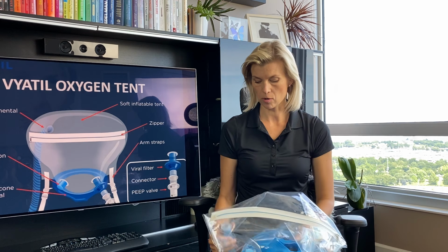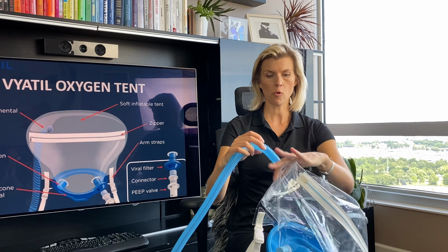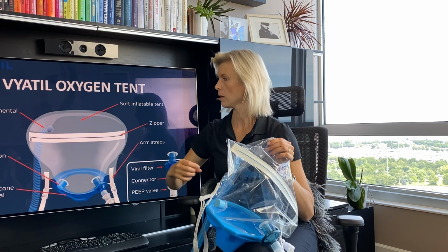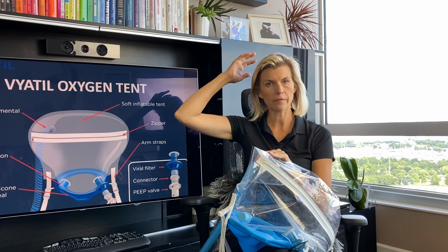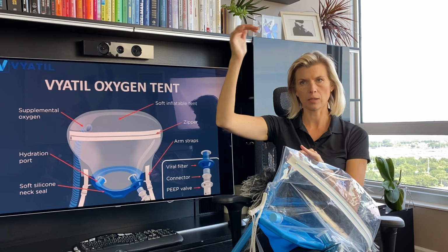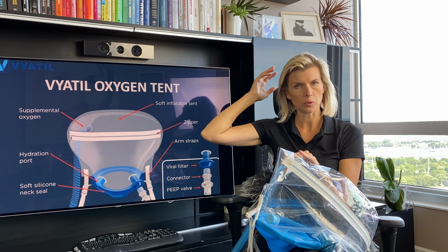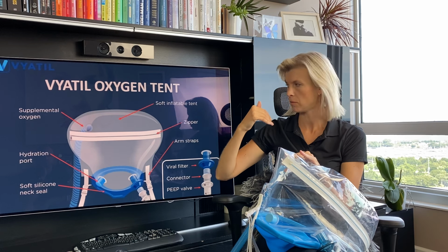And here is our input port for the air, and it's in the back of the tent. The reason for that is that it's more comfortable, it doesn't get in the way when the patient is moving, and also it is less noisy for the patient. It's not going straight into your ear.